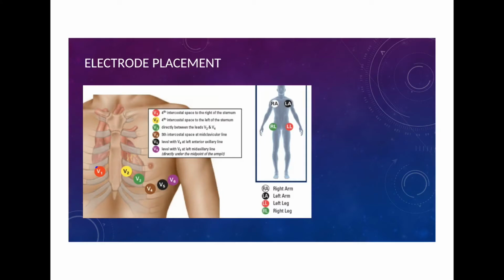Starting with how to perform an ECG on your patient, a common ECG machine will have 10 wires coming out of it. These are called the electrodes, and you're going to be positioning them on your patient in specific ways. Starting off, you have 4 electrodes that are going to go on the patient's limbs, the right arm, left arm, the right leg, and the left leg.